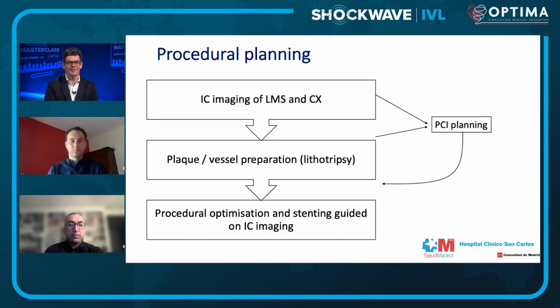Thank you, Brida. So, yes, in summary, what we consider is that, in this patient who has a protected left main stenosis, heavily calcific, you will see in a second more detailed images, we should first obviously guide our procedure using imaging. It's important to see the effect of plaque preparation before stenting, making sure that we get where we want before implanting the stent, and of course optimizing stenting.